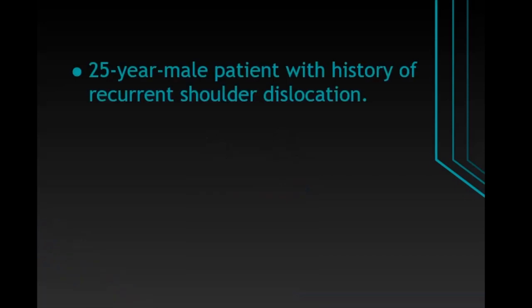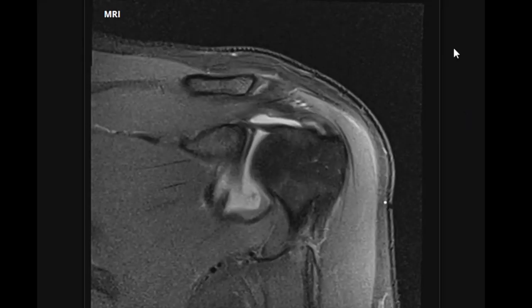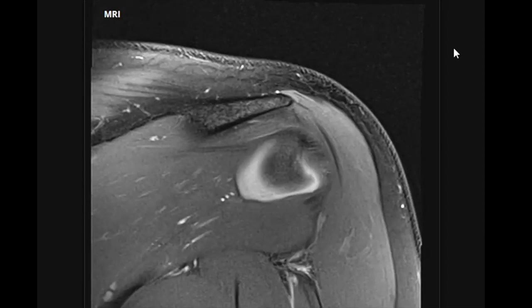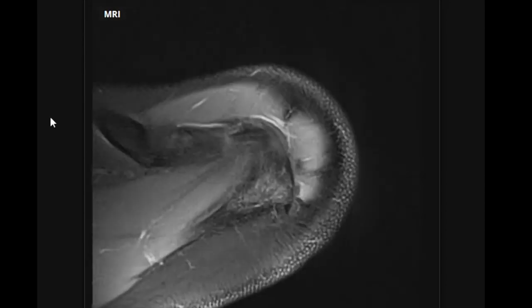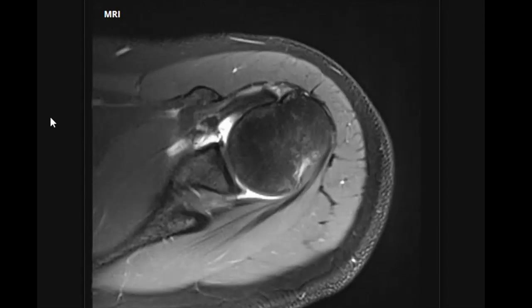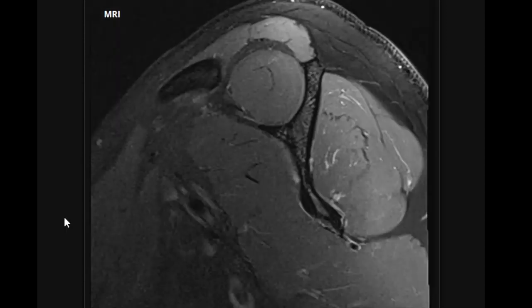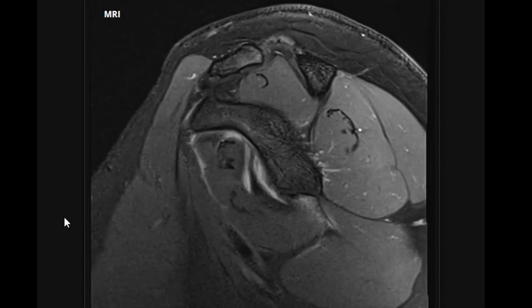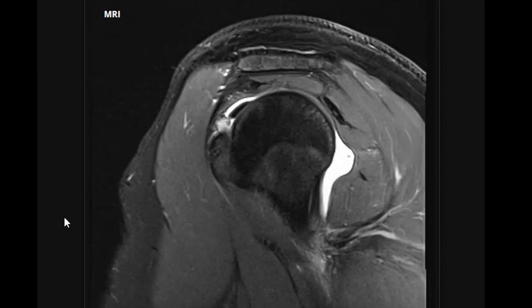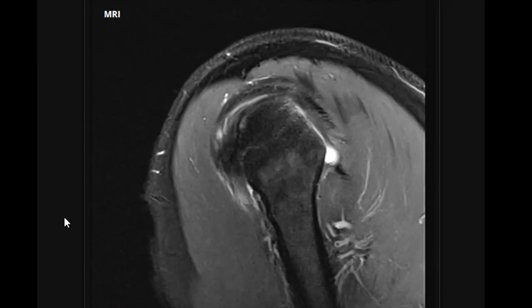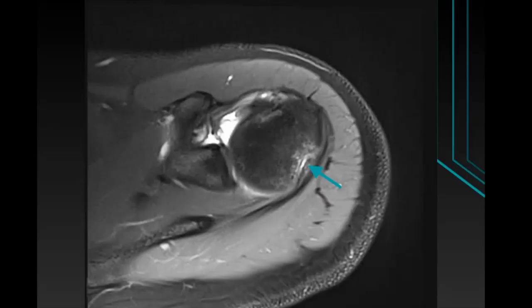Starting with case number one, an MRI was performed for a 25-year-old male patient with history of recurrent shoulder dislocation. On axial PD fat sat imaging, there is a compression fracture involving the posterior lateral aspect of the head of humerus with surrounding marrow edema at the level of the coracoid process, consistent with a Hill-Sachs lesion.